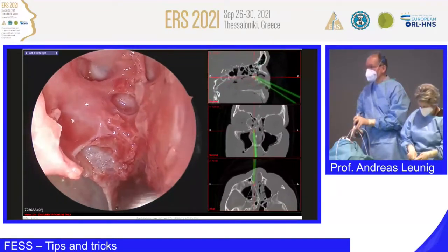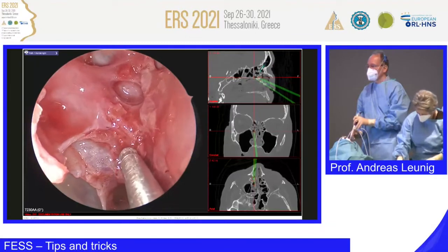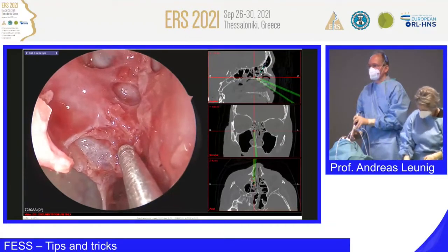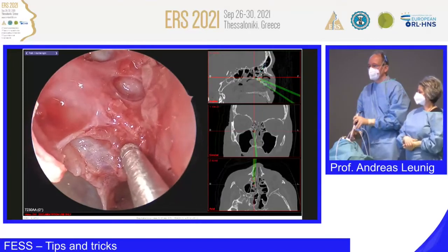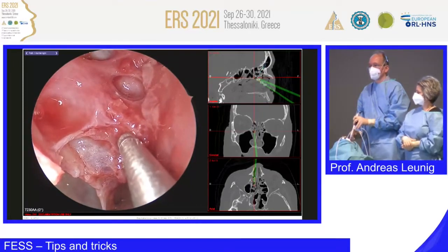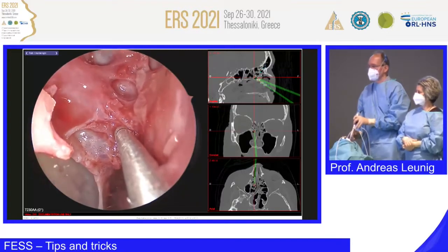Okay, so we're now using navigation. We are not having the pathway visible now, we will do it in a second. But you see here, I'm just in front of, maybe, the ground lamella. It seems to be. Pathway number 3.